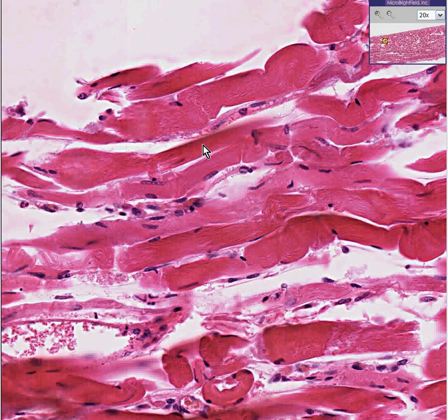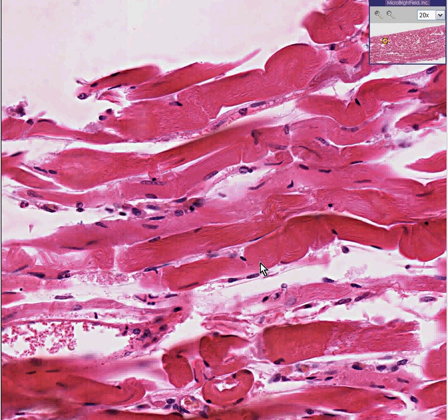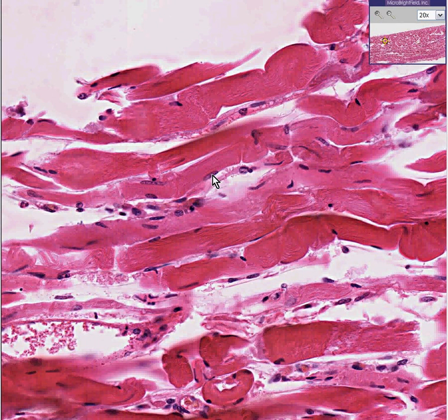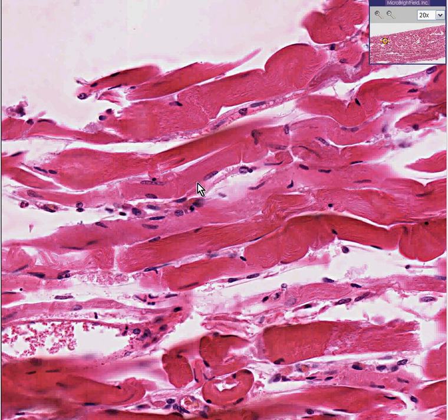You could recognize instantly as we zoom in that these are normal skeletal muscle fibers. You can see some striations here, and lesser well-defined striations in other areas. The nuclei are all at the periphery and they are arranged nice and log-like. So this is skeletal muscle.